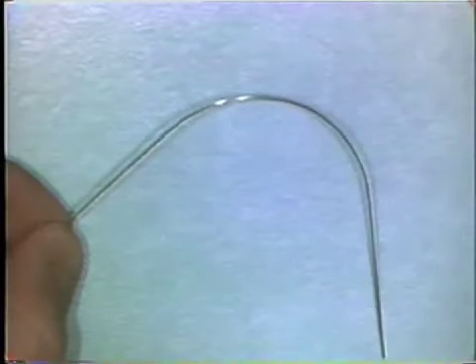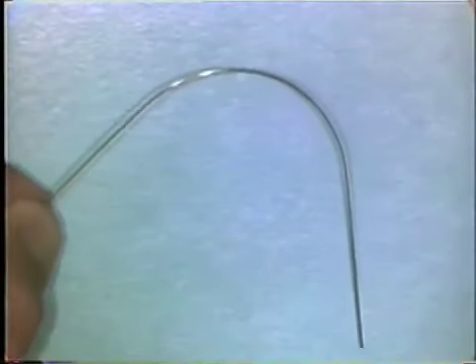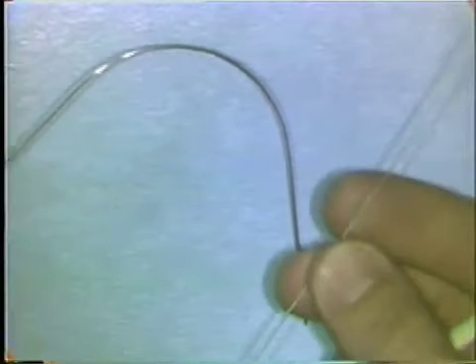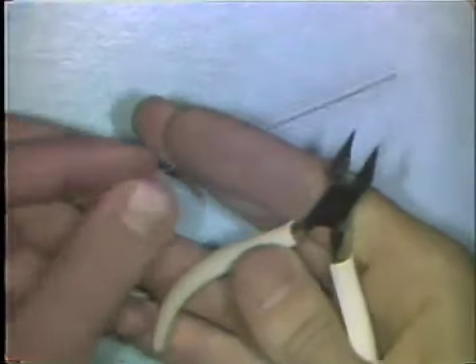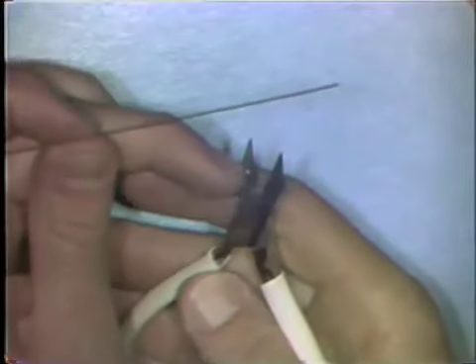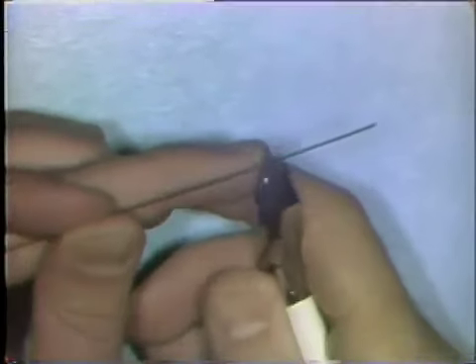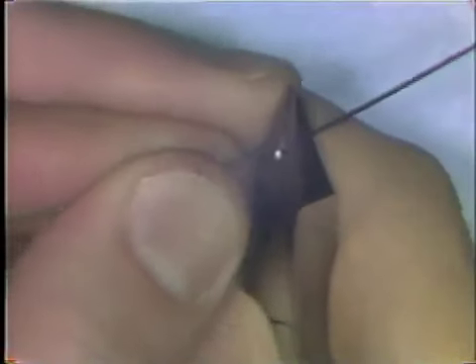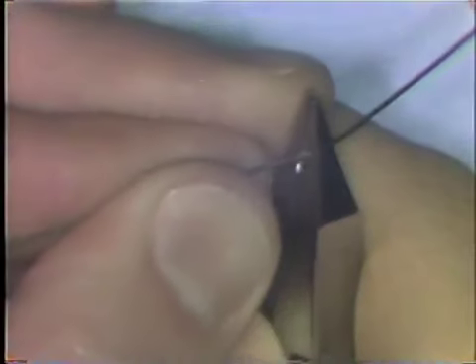Curves are formed from a series of small bends that are very, very close together along a wire. To make a curve, you use the 139 bird beak pliers and you place the wire deep into the plier beaks, near the larger portion of the round beak of the plier. Using your thumb, make a series of very tiny bends very close together in the wire and this forms a curve.